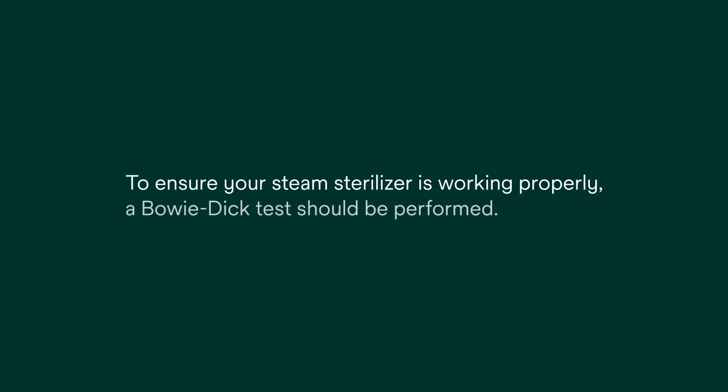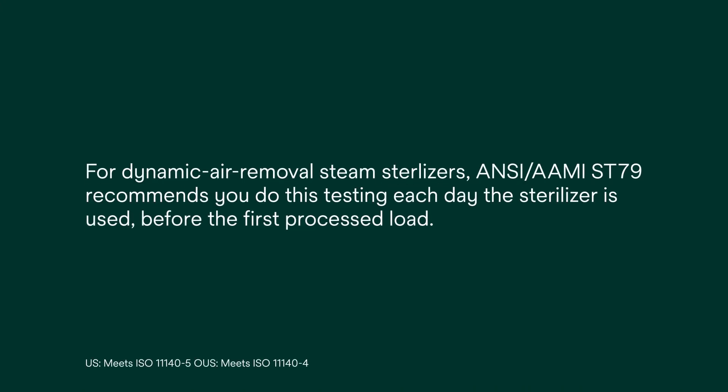To ensure your steam sterilizer is working properly, a Bowie-Dick test should be performed. For dynamic air removal steam sterilizers, ANSI/AAMI ST79 recommends you do this testing each day the sterilizer is used, before the first processed load.